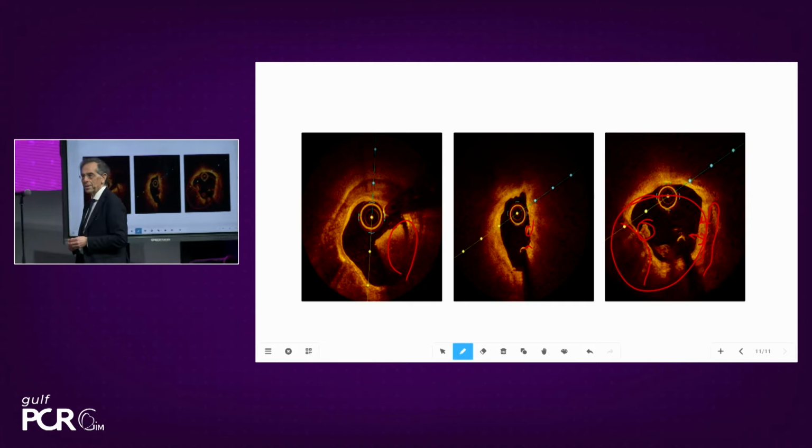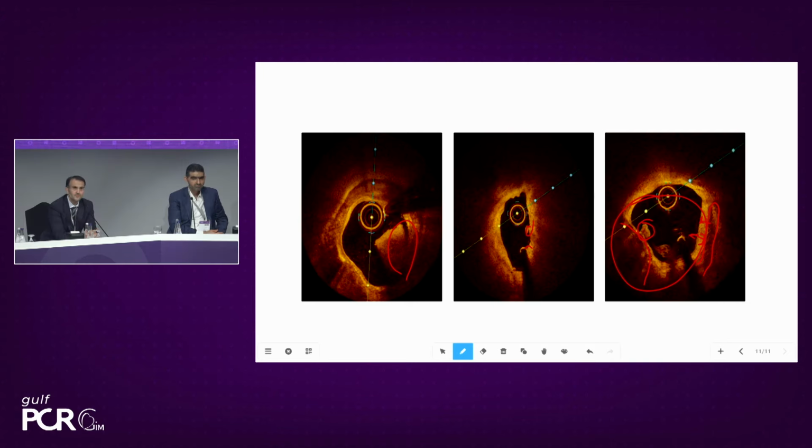Other questions? Okay, considering yesterday's talk with Dr. Fajr, the panel, and also you, and today's talk and presentation, in the beginning you asked me what I would do. All I would do is open that very severe proximal LAD lesion. The calcified area was not narrowed, and calcification per se is not that important. If it is narrow and flow limiting, then we have to do something. So I would simply put a stent there and forget about everything else.